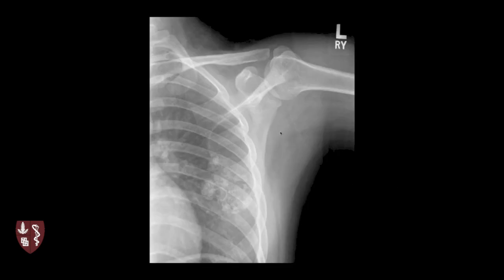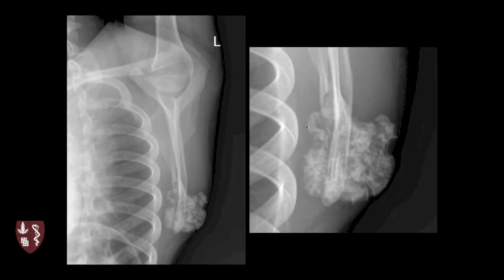Here's an example in the scapula. On a chest radiograph you might confuse this for a pulmonary mass or chest wall mass, but on the scapular views you can see it's an exophytic lobulated mass arising from the tip of the scapula, varying in density but well-defined. This is a pretty good look for a chondroid-type lesion. Some have a lot of bone on them; some have more of that chondroid appearance. Usually it's the non-calcified cartilage that people worry about as potentially transforming to malignancy.